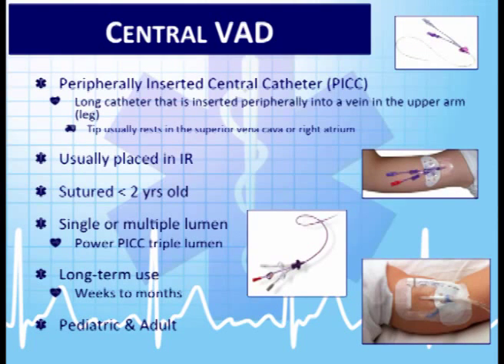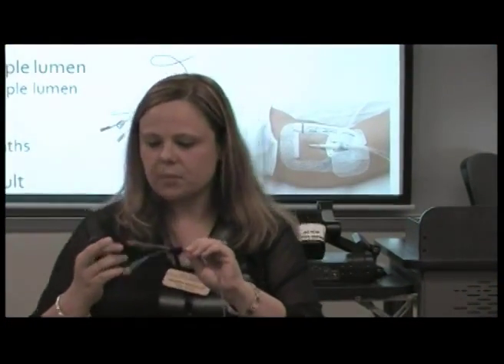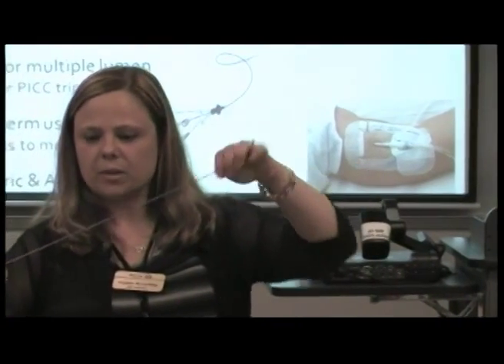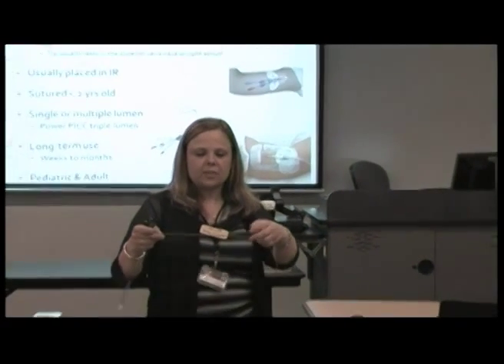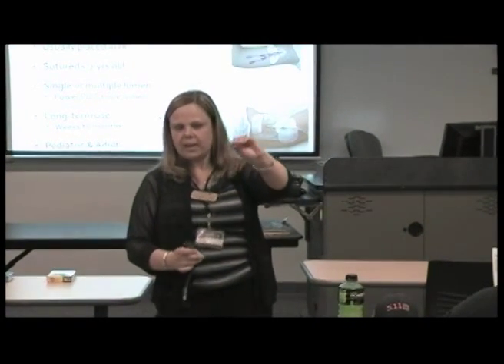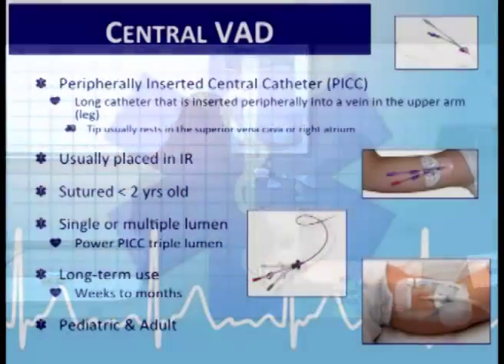See if I have any more examples up here. There's another one here. You might hear power PICC line. Okay, the power PICCs. It'll say power PICC on it. Another example, different PICC line. You can see how long once they put them in, and you see how long the patient's arm is and how long they need it. The doctor will estimate and will cut. So it's not saying that every person is going to have this whole entire length in their body.